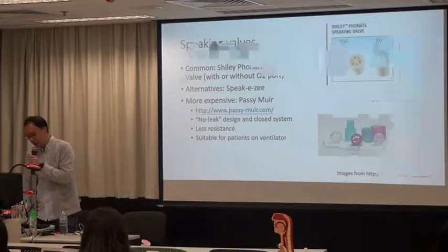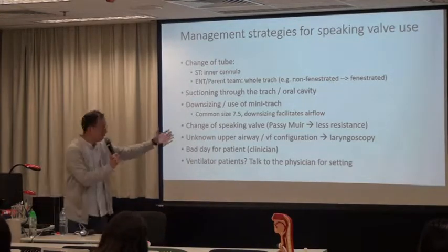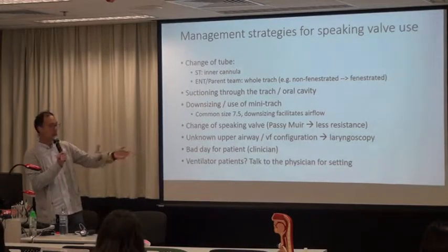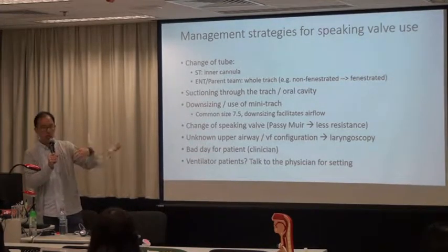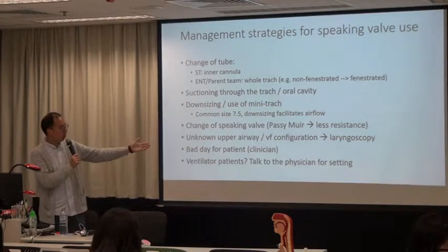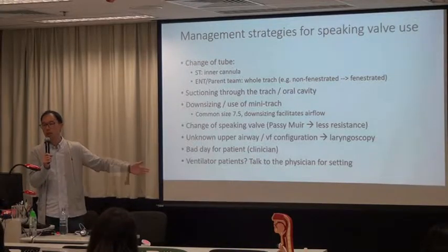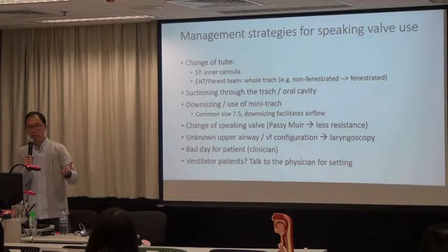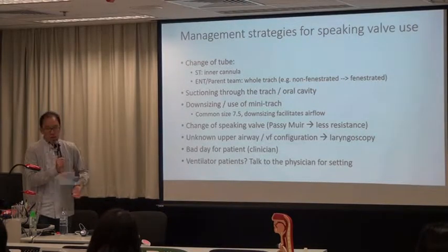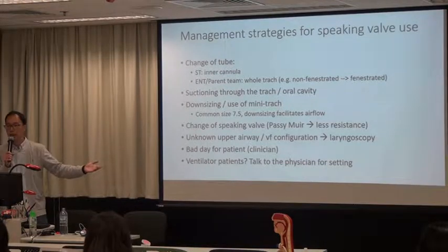So this is another strategy that you can use, or, as I said, laryngoscopy. Okay, ask the ENT, or if you're confident, do the endoscopy yourself. Or it could just be a bad day for you or the patient. Okay, come back another day. If you are very convinced that the patient's vocal folds are fine, there's no upper airway obstruction, there's no sputum whatsoever, the patient should be able to talk, then come back another day.